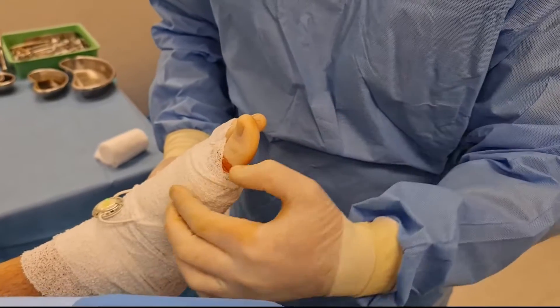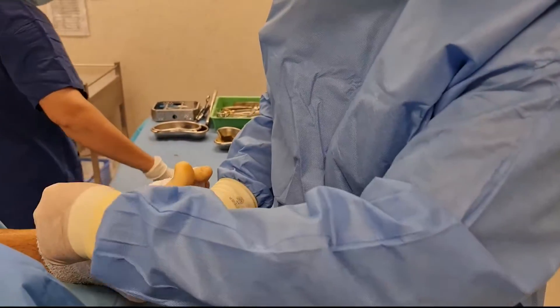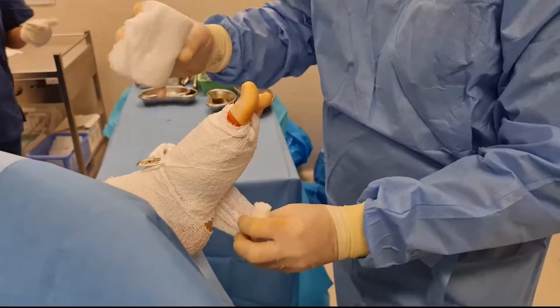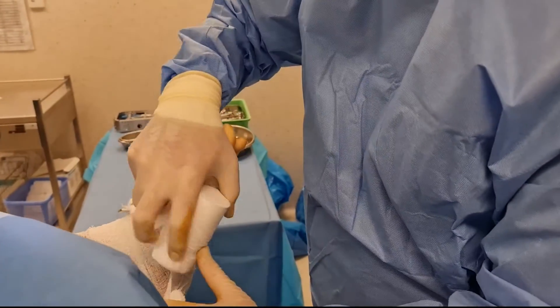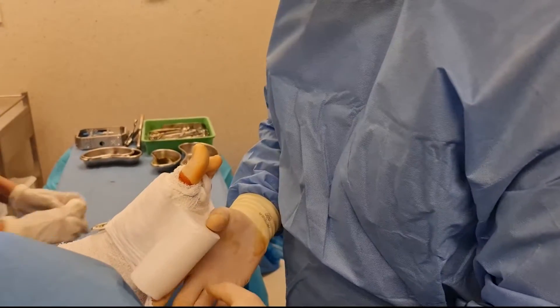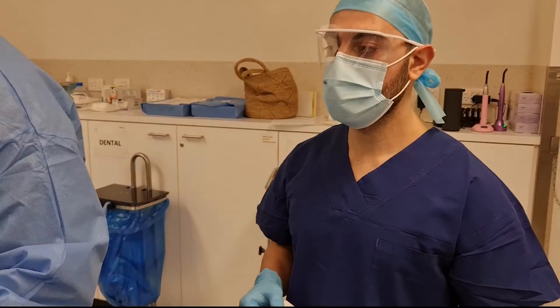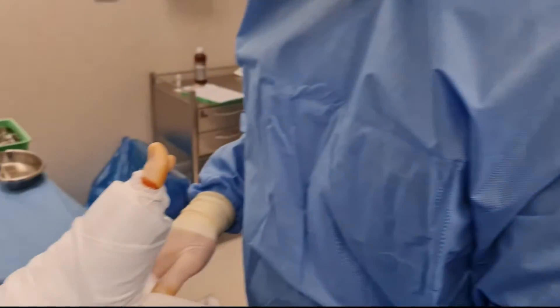So placed on the patient now. The operation was done around the first MTPJ, so we've positioned it there. I've got some soft band around that. It's completely drug-free. The device will continue to work for 720 hours. The patient can wear it for up to a week at a time, and then can adjust by turning it on and off as needed after that first week, depending on pain levels.